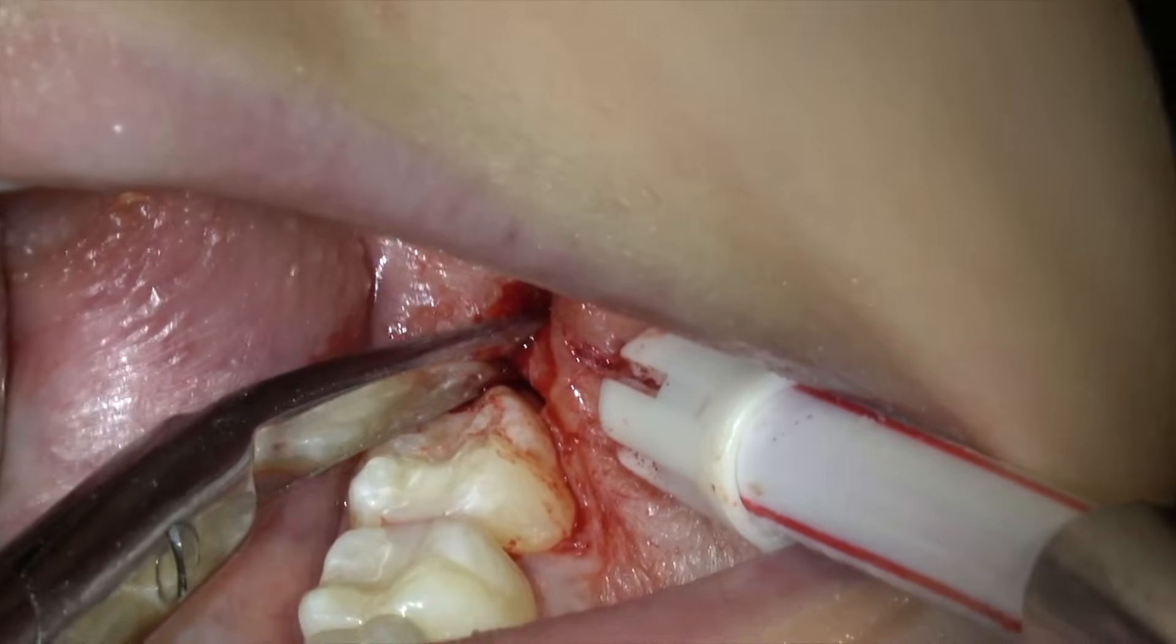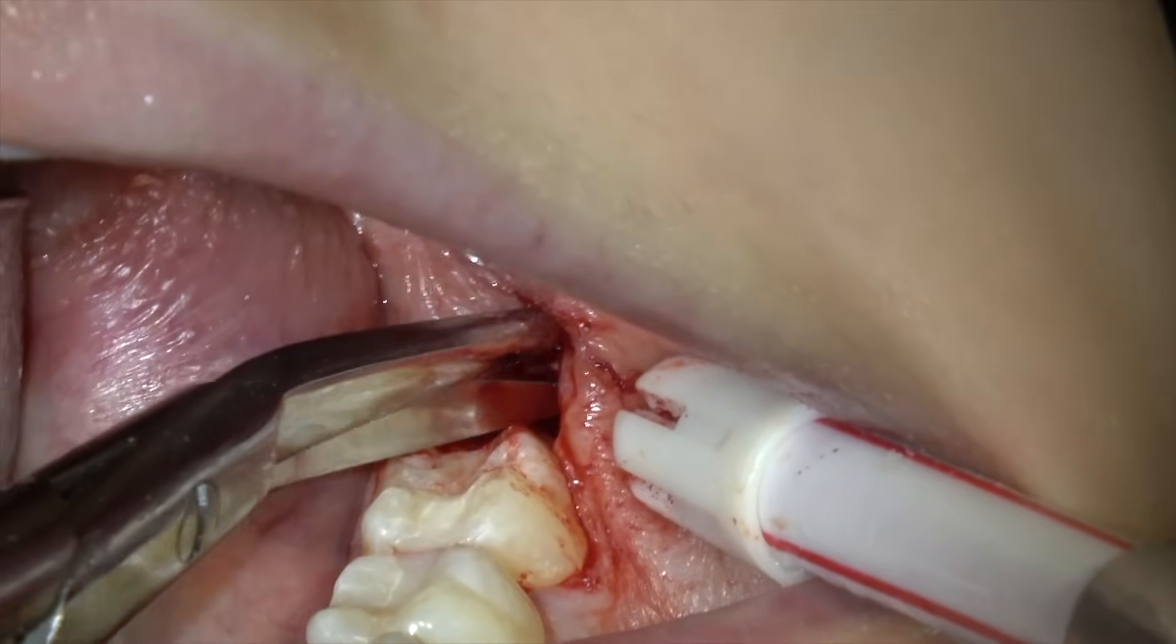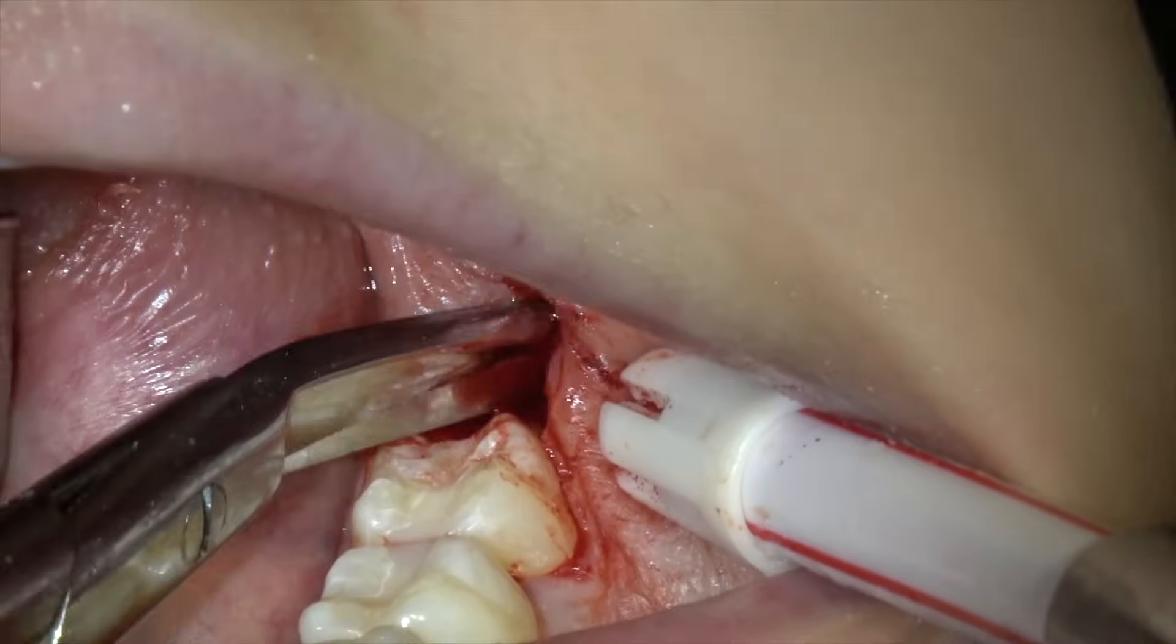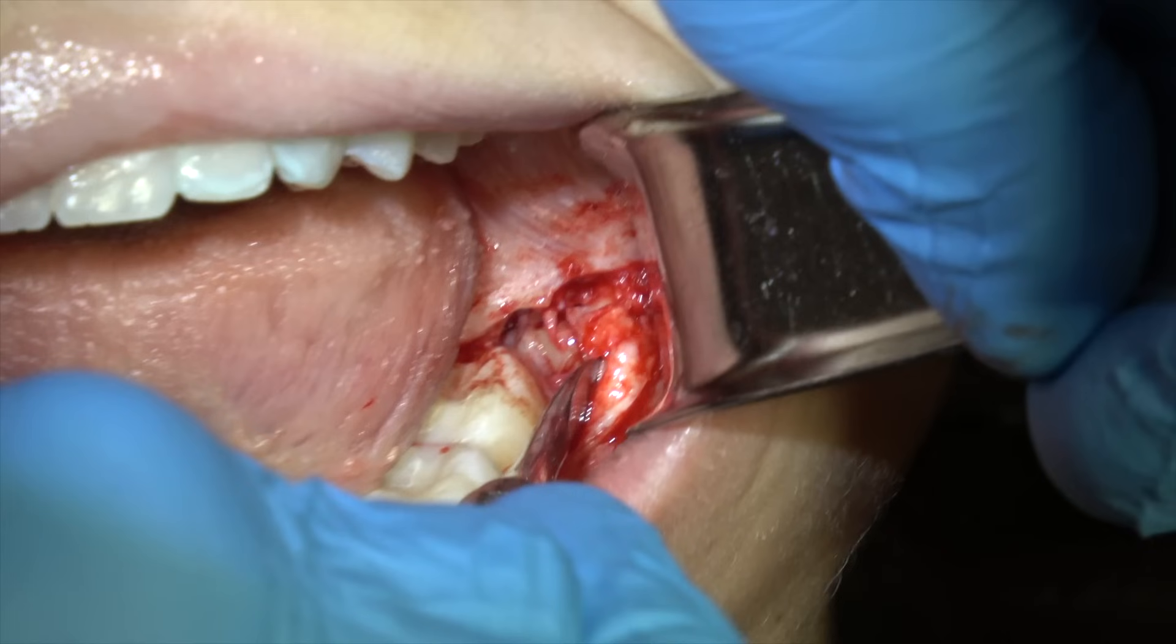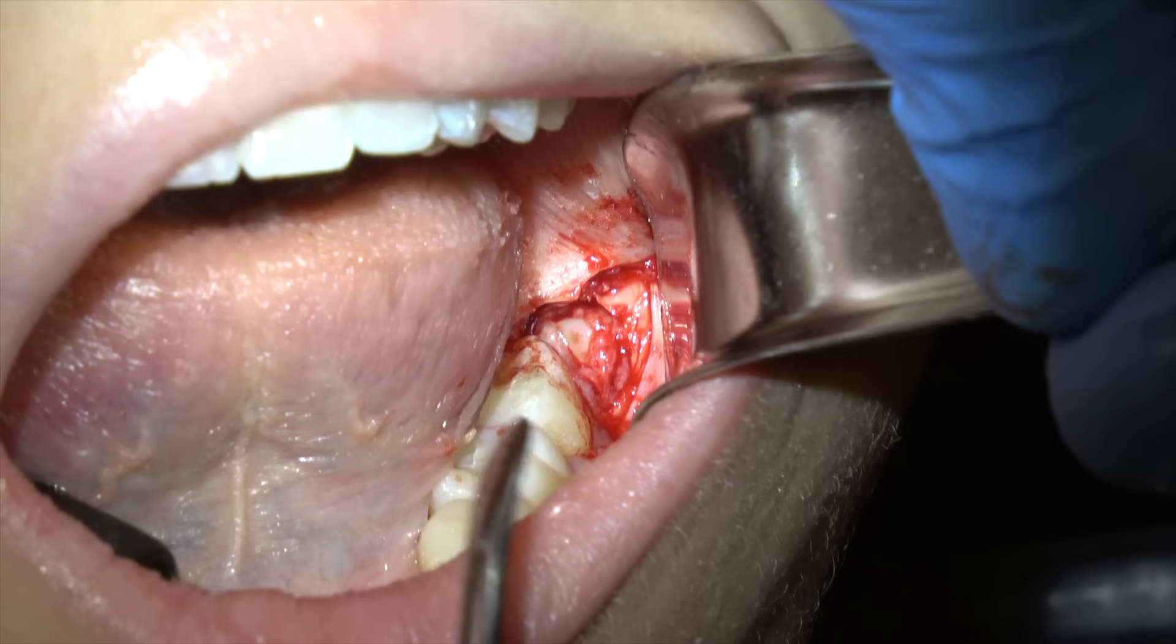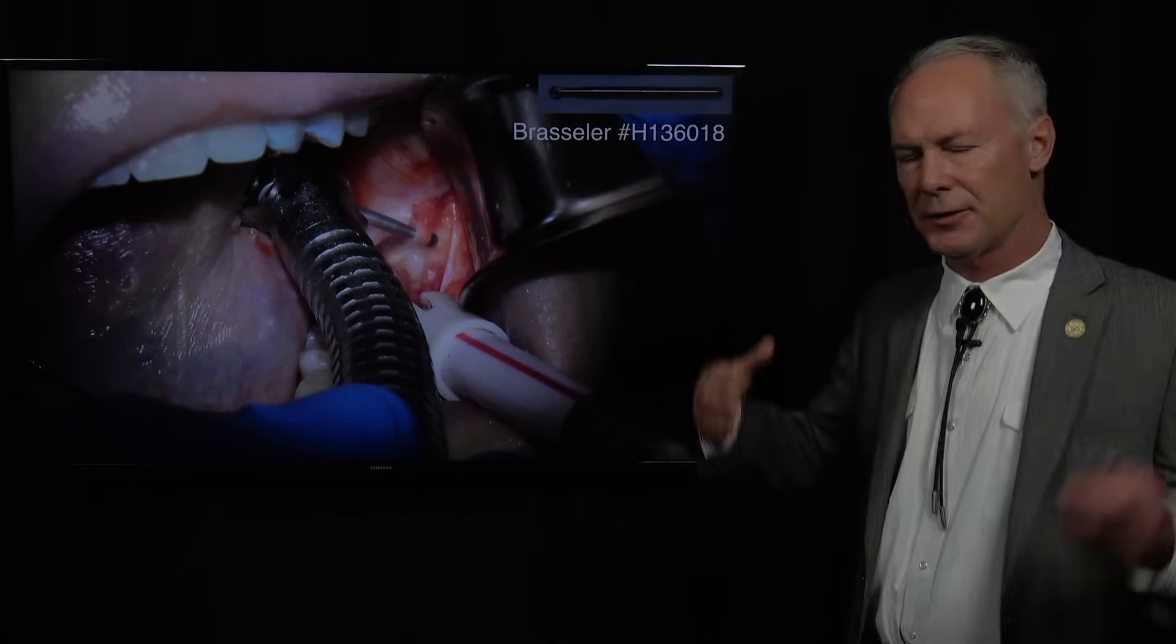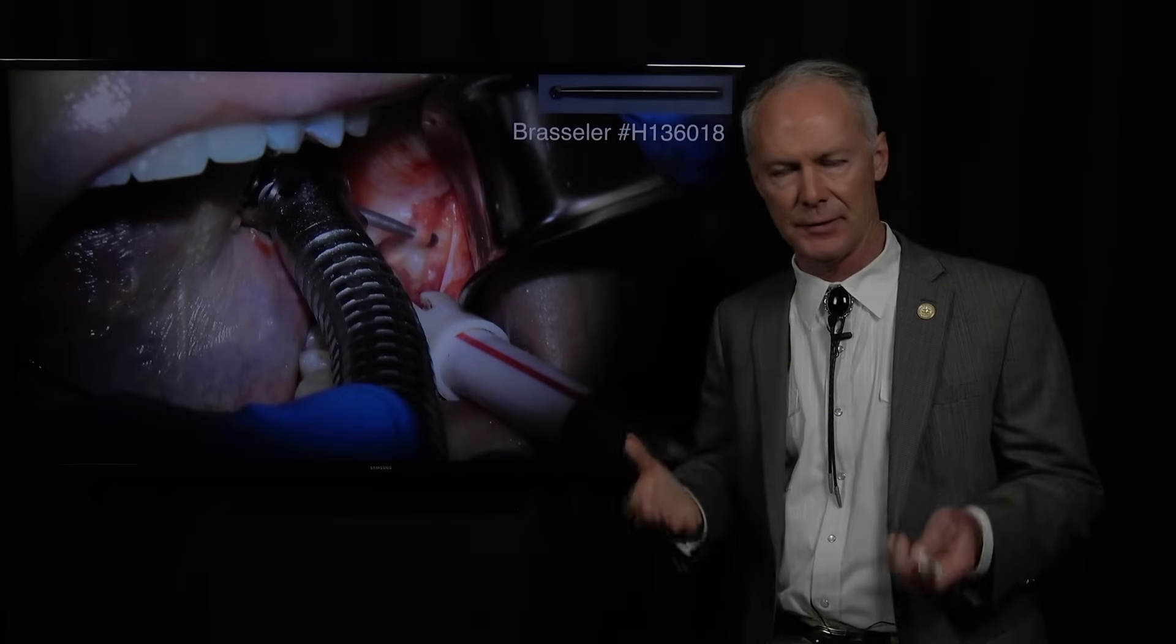Now I'm coming back with my scissors and just cutting all the way through the soft tissue. You can see that wisdom tooth is exposed and in those cases you have to remove some bone. I try not to remove any bone or cut any bone if I can help it, but most of the time you're going to have to remove some bone.